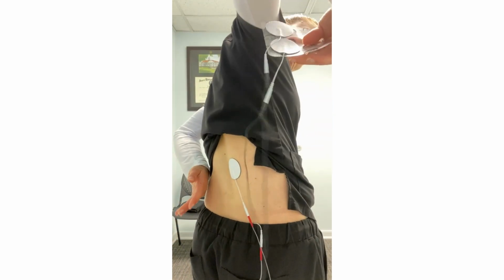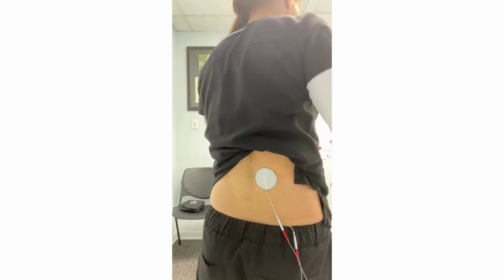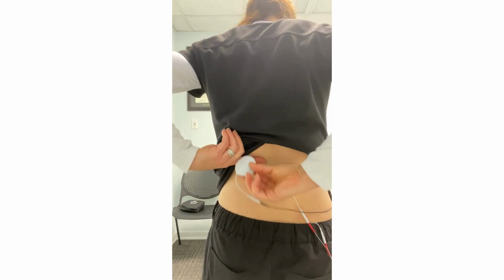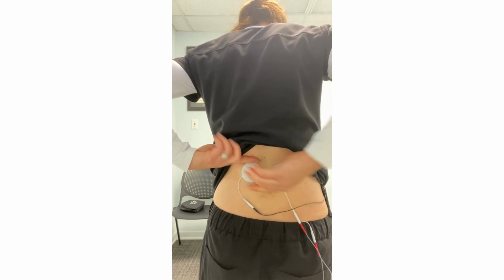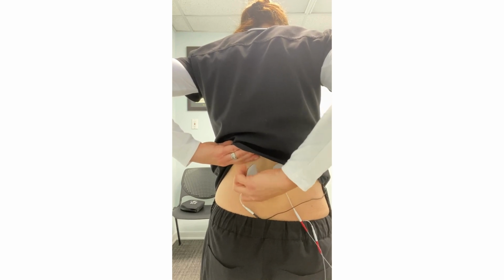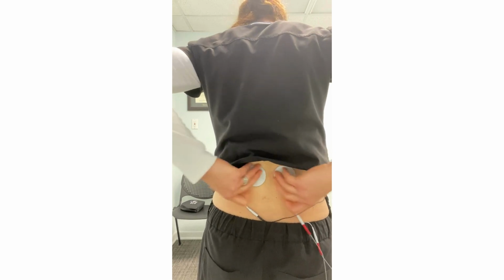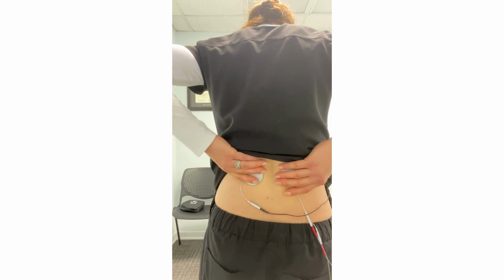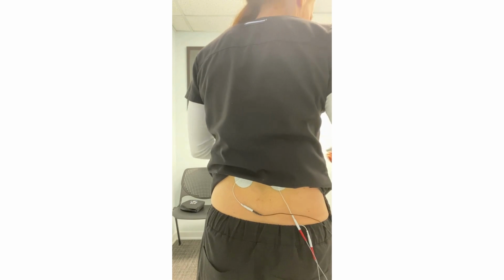I will take the black leads and I'm going to pull them off. And same thing, I'm going to try to trace right over and place it there. It feels a little off. And again, maybe not exactly perfect. I still feel like that's a little low. Let's go there. But I'm doing this without a mirror.